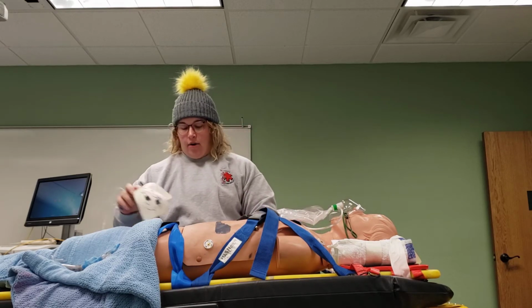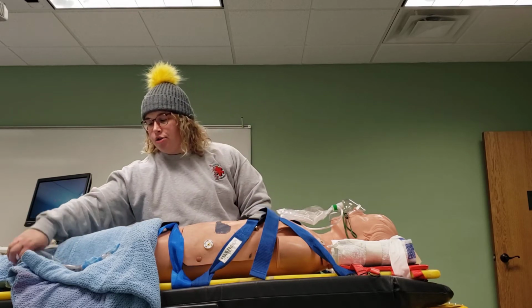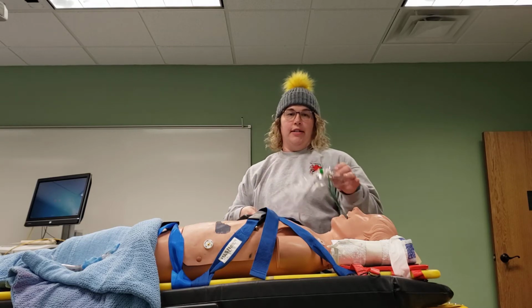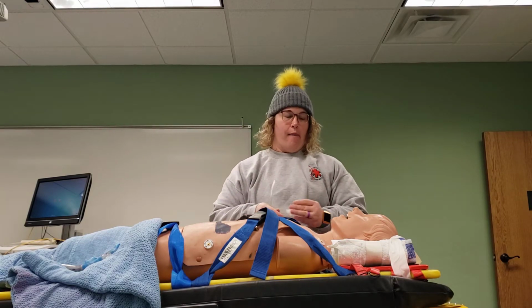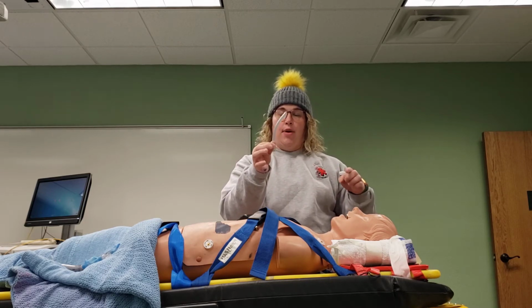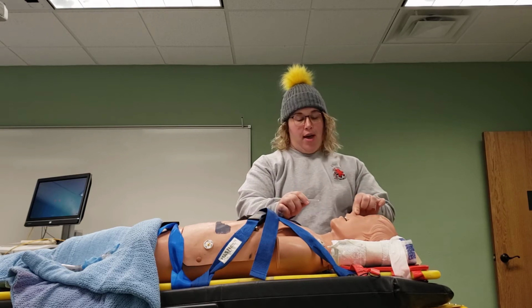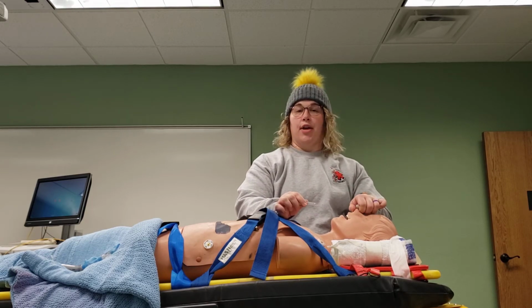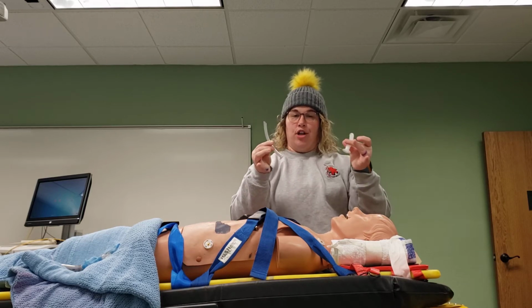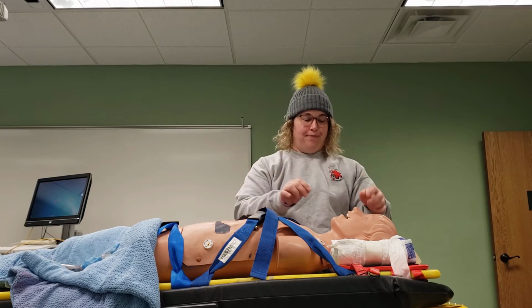So the cardiac arrest has been ongoing for a while. I want to secure the airway, and I'm going to use my airway devices that I have in order to do that. Now, some providers will use 2 NPAs and 1 OPA and plug all holes. I wasn't trained to do it that way. If you want to plug every hole you can because you can, that's fine. But 1 should be sufficient. They're made to operate on their own, not together.